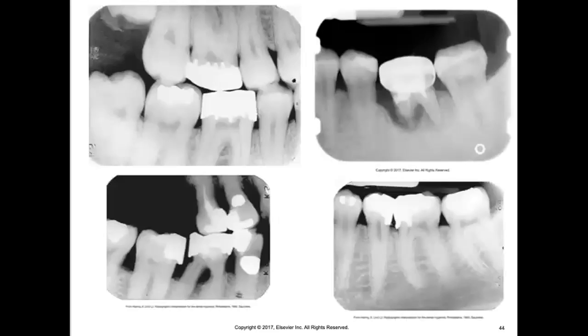Okay, here is when we see some defects with some crowns. So we'll start with this upper left picture here. So this is a very ill-defined crown or ill-defined margins. We can see some overhangs here. Right underneath here, this is a perfect floss shredder, I would say. Every time a patient would attempt to get floss through here, they'd most likely catch their floss on these overhangs here, tearing their floss. So I bet that they're not going to want to get floss through there very often. And because of that, we can already see some vertical bone loss around or underneath this restoration.